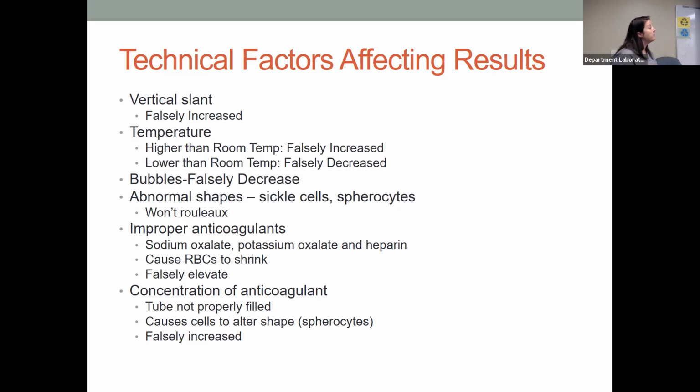And then again, any type, yes, sir. A question for you tomorrow on temperature, right? It seems to me like there's probably going to be a lot of variation in temperature. So is that something that gets reported, like the temperature of the day that I had? Actually, that is something that your lab will monitor on a daily basis. You will have an ambient temperature thermometer to test. And so that'll be part of your daily QC, monitoring that temperature. And we'll do that in blood bank, especially because we're very temperature dependent. And then other labs too, you have to record your ambient temperature.